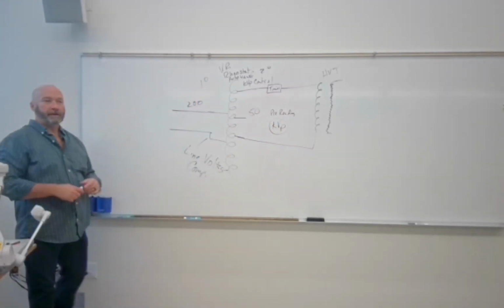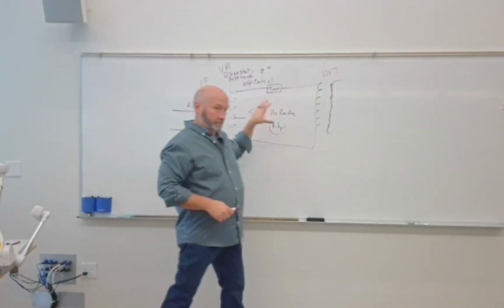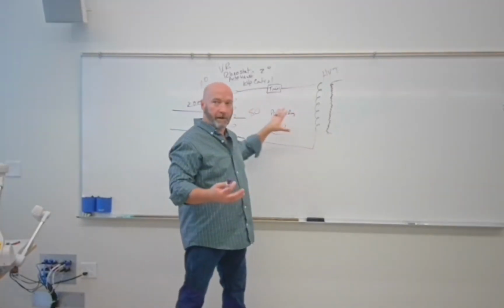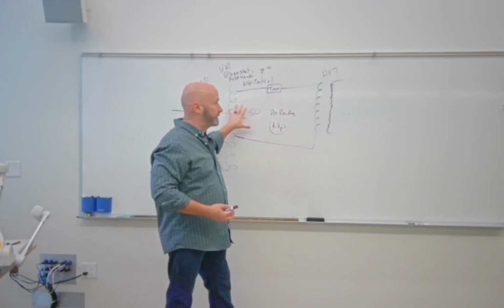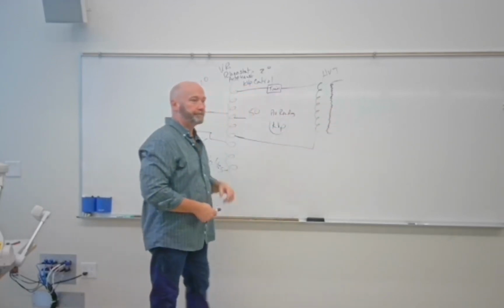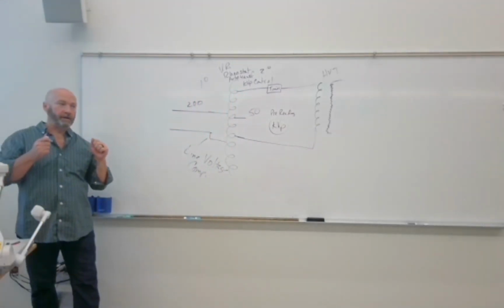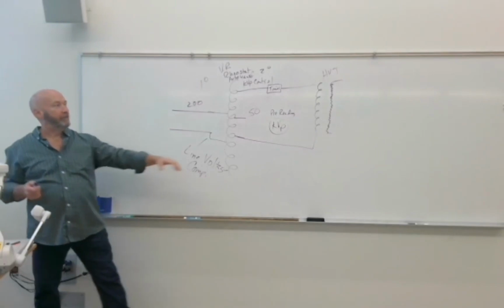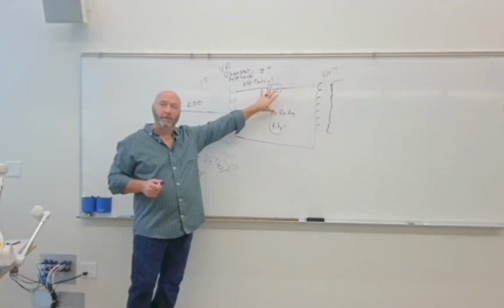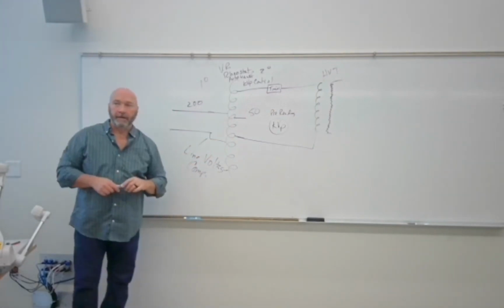So that takes care of our kVp, right? We have an adjustment to set our voltage, which becomes kilovoltage over here. So we've taken care of our kVp. But we also have to have a way to control our mA, right? We have a way to measure our time. We'll get there in a minute. But we also have to have a way to adjust our mA, right?